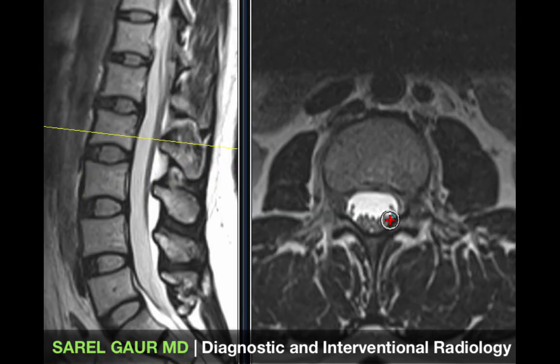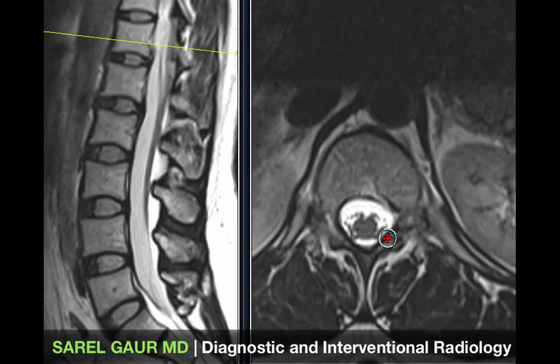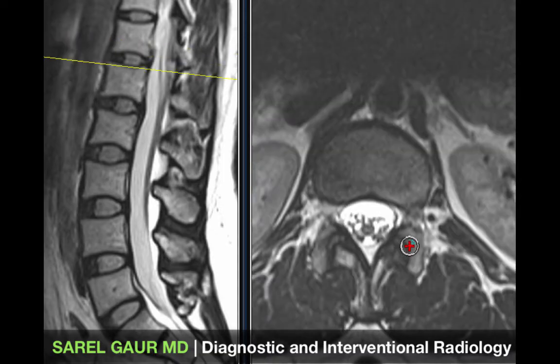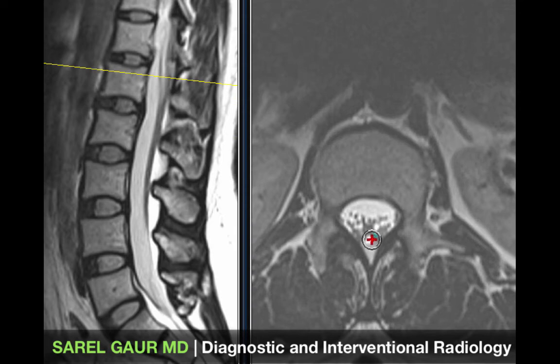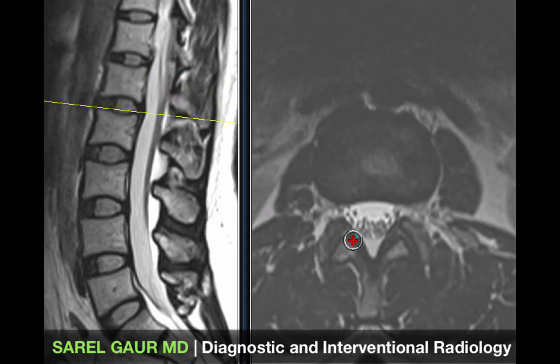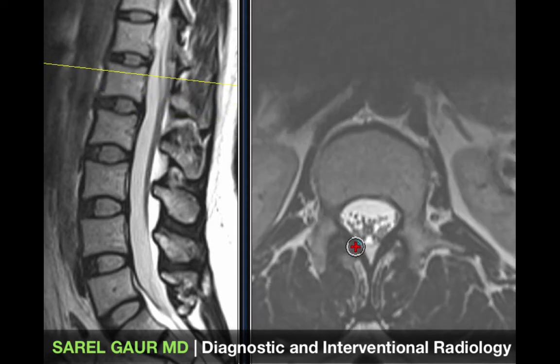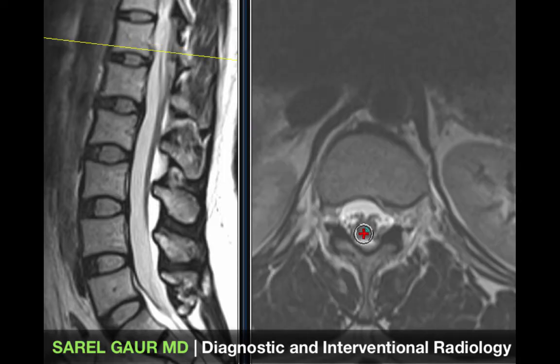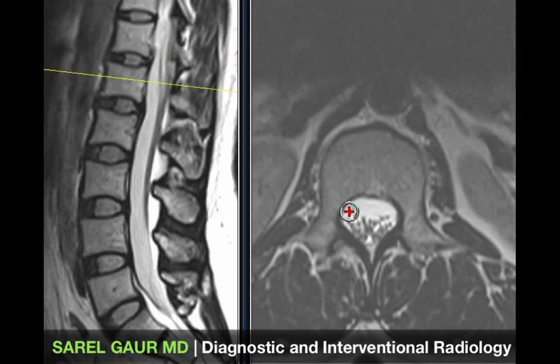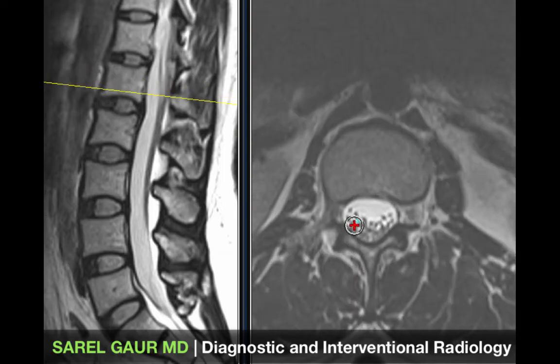Scrolling up, you can see how the spinal cord goes from being a solid mass and turns into individual nerve roots as you come down lower. This is the conus of the spinal cord going into the cauda equina. Cauda equina is Latin for the horse's tail, which you can see from all these individual small nerve roots floating in the CSF.